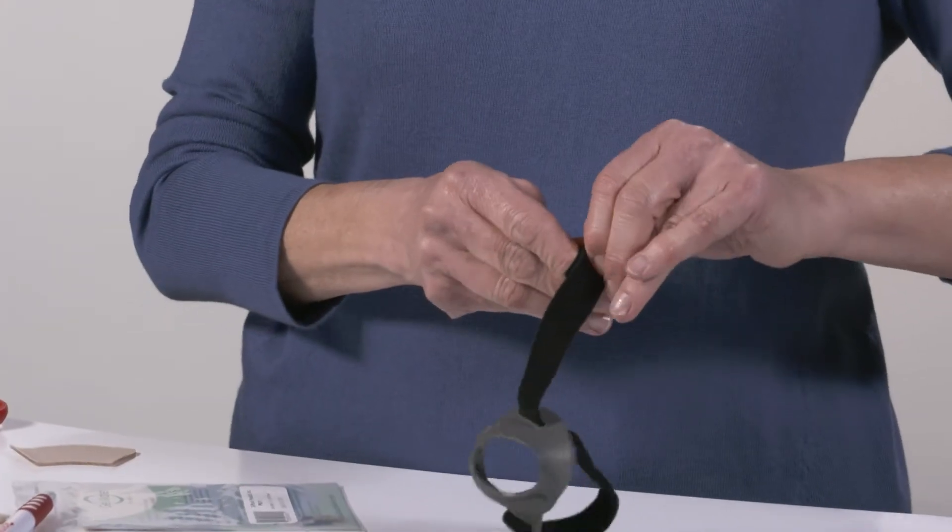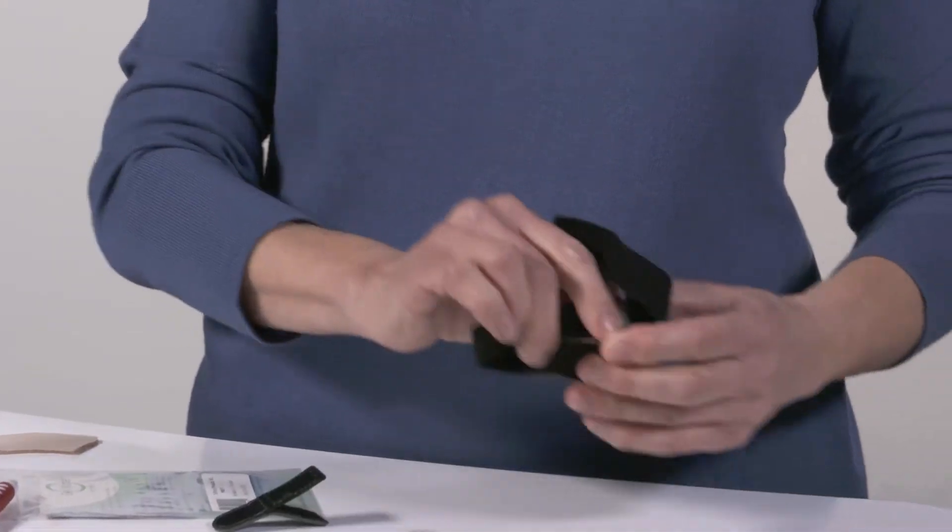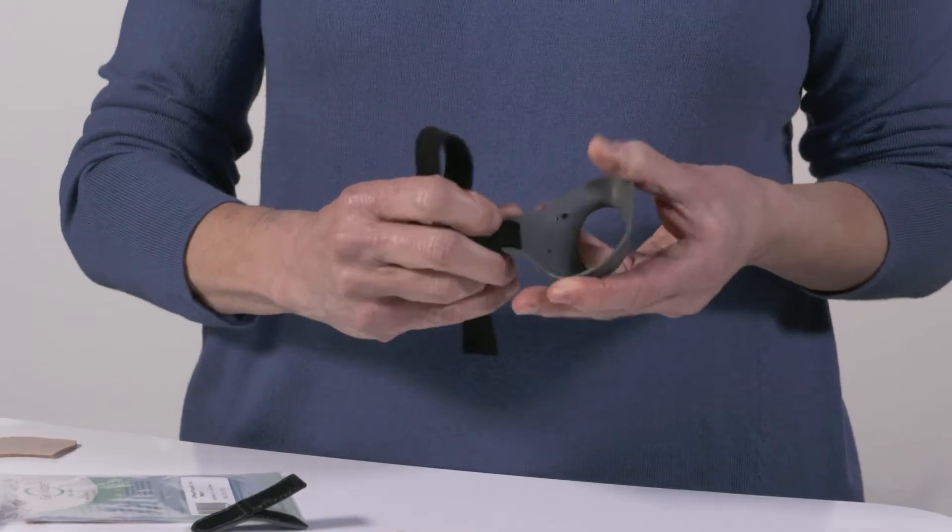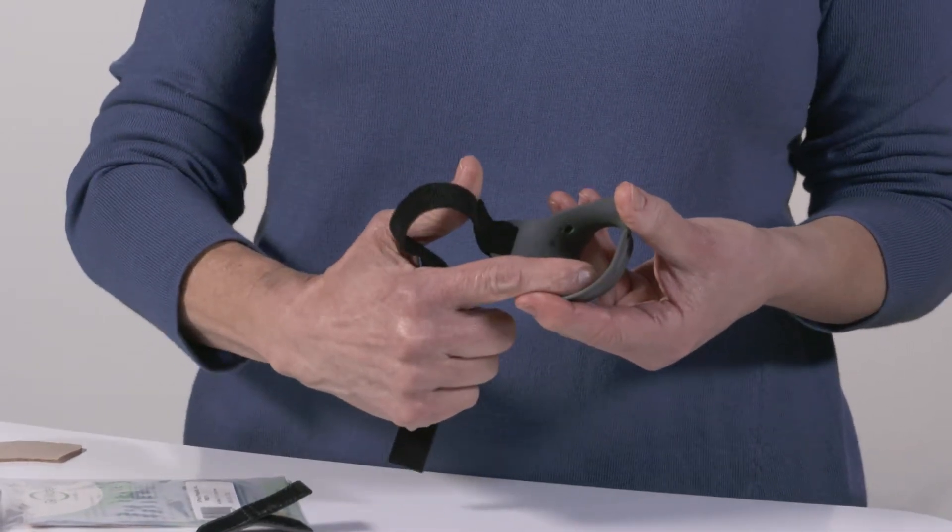Remove the strap by first opening the tab and pulling the strap off, and pull it out of the brace so the area where you're going to put the pad is open.